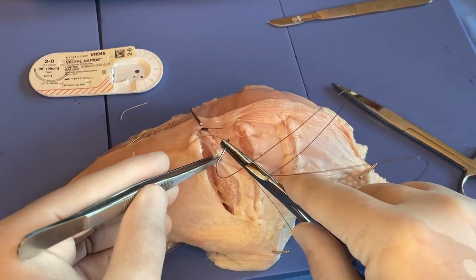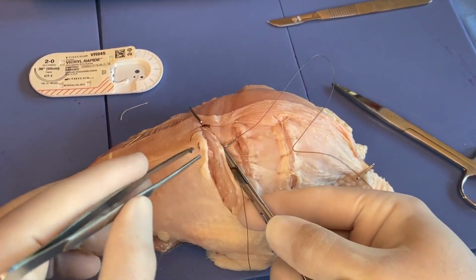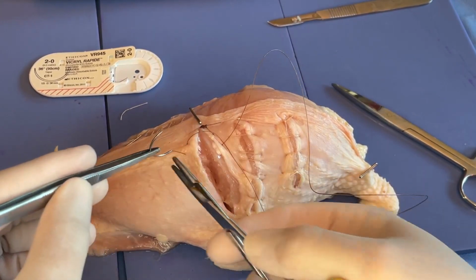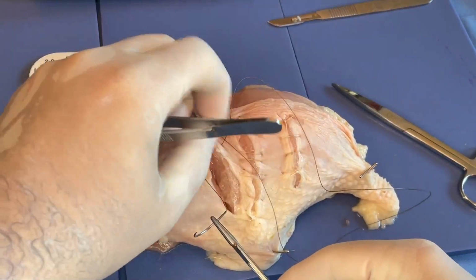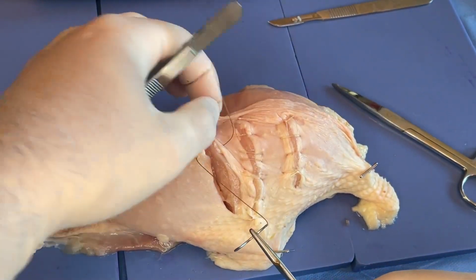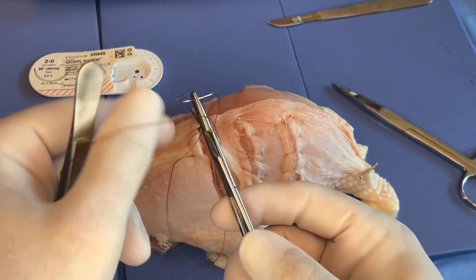So let's look at that again with our next one. So we go down through, and then up and through. Use the needle driver, finish curving that needle out of the tissue, re-grasp here, and again, we're going to want to, and our assistant would be helping us with this, here's our loop. And so we want the needle to come through the loop.